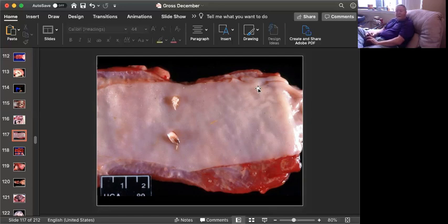And this can be the result of bovine papillomavirus type 4, which is a goodie. And there are also reports that it can happen from bovine papillomavirus type 2. Papillomavirus type 2 generally affects the skin. It causes large fibropapillomas, which have both a mucosal or epithelial proliferation and a proliferation of fibrovascular core. They're usually big, hefty neoplasms. But I learned this as bovine papillomavirus type 4. It's only recent that I've learned that bovine papillomavirus type 2 can also affect the upper GI tract.